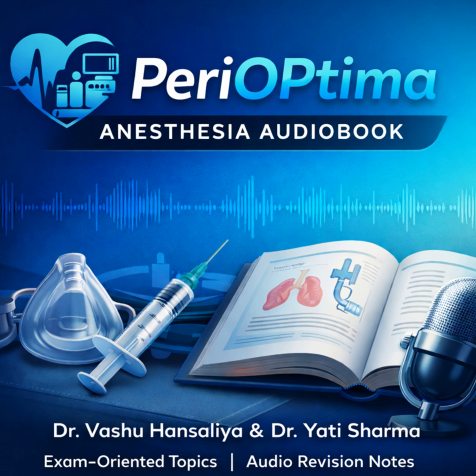And spontaneous. The patient is the boss. A spontaneous breath is started by the patient and ended by the patient. The machine might help out, but the patient is in the driver's seat for timing. Okay, we have the building blocks, the equation, the control variables, the phases of a breath. Now, let's build the actual answer for that 20-mark question.